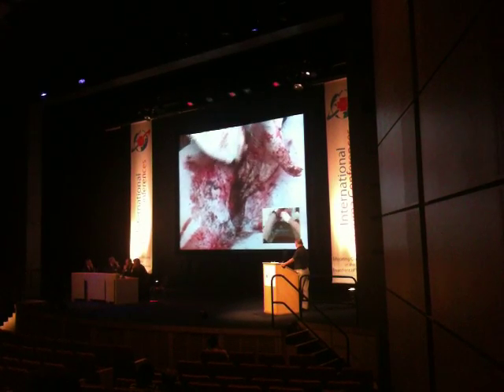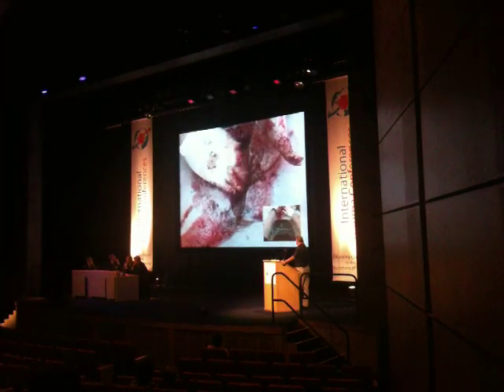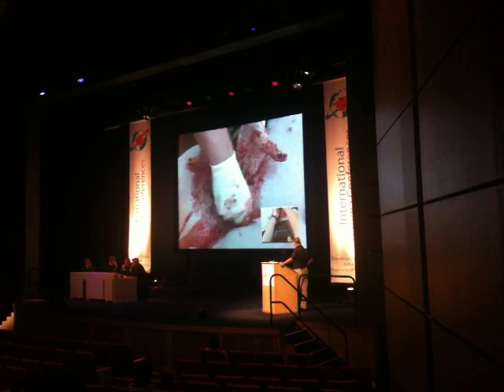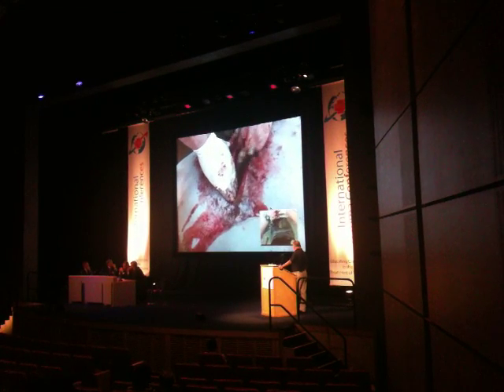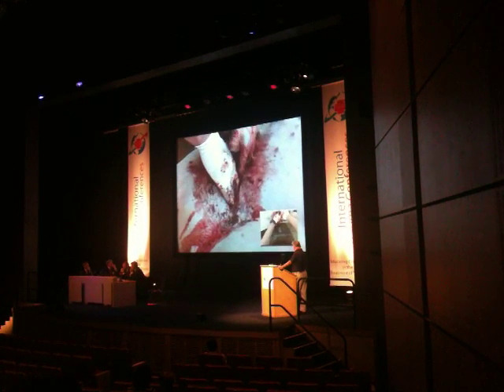The agent does not dry, and there is no exothermic reaction, so there's no increased temperature. Still maintaining some element of pressure with the left hand, transferring with the right hand, continuing to move agent around to where it's most needed.